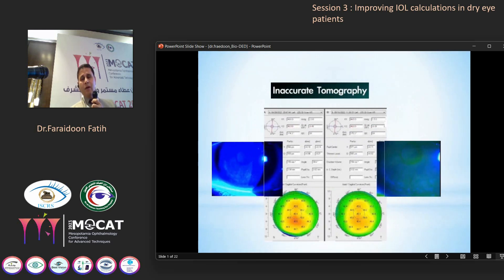Inaccurate tomography, we can see this patient with corneal staining and hot spots, which improved after giving treatment.